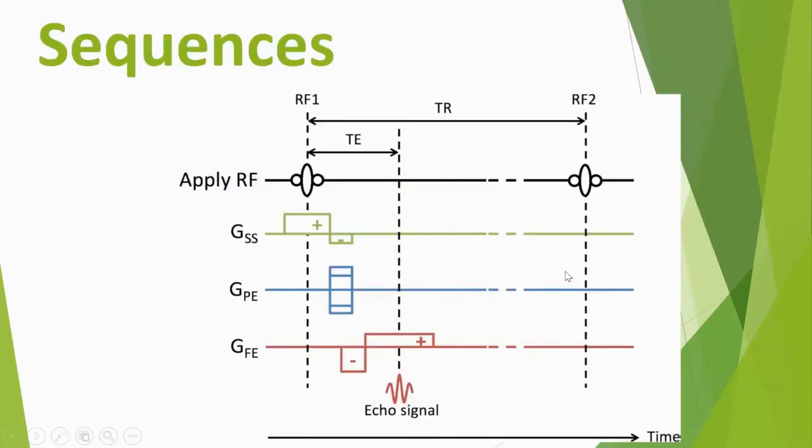These are the values. Now, we discussed that I have a 90-degree pulse, and then I use a 180-degree pulse. We also talked about the slice selection gradient, phase encoding gradient, and frequency encoding gradient, and we understood what each one does in spatial encoding. There is an important point we mentioned: I give every signal a 90-degree pulse, I wait for half of the TE, then apply a 180-degree pulse, and after that I wait for another half of the TE and record the signal. Okay, we were saying that with each TR, with each pulse I apply, I have a single signal.